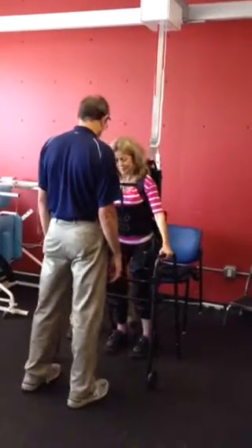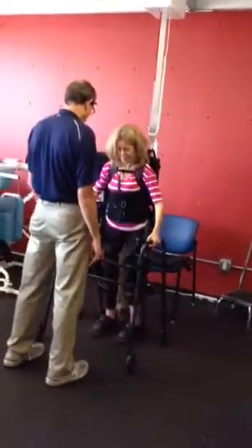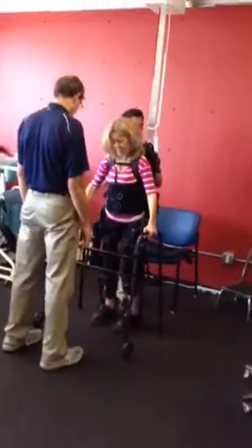Remember, before you walk, we're going to have to learn how to shift the weight down. So stay within the walker. Let's practice just leaning to your left.